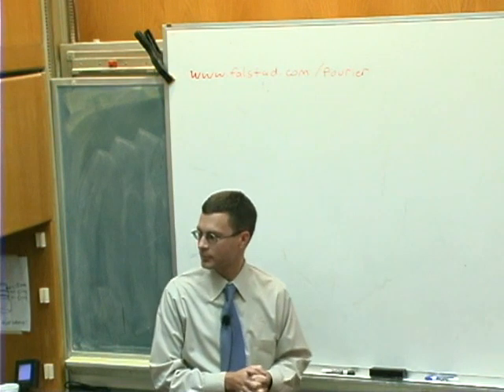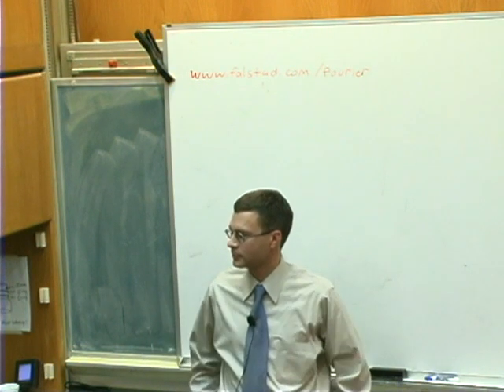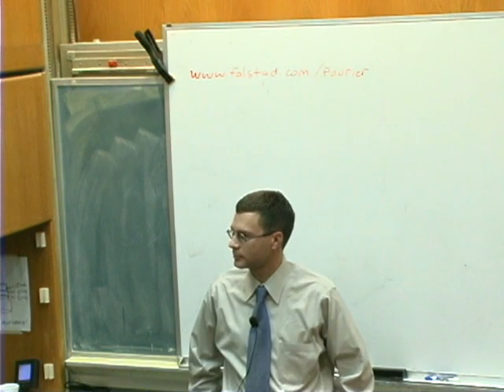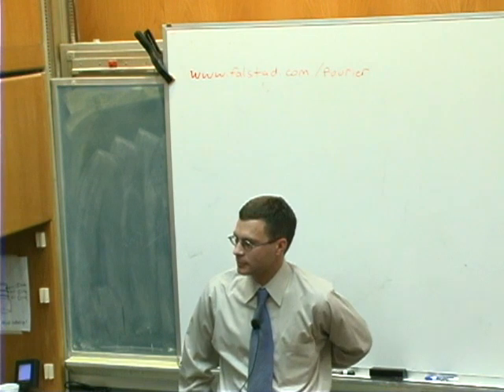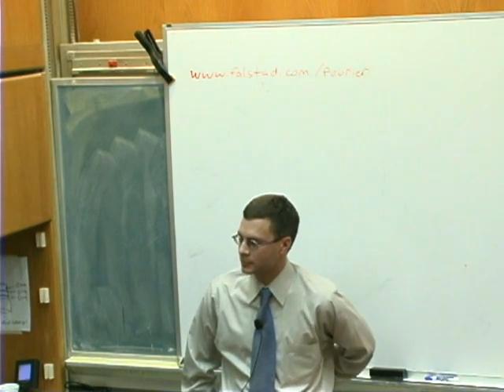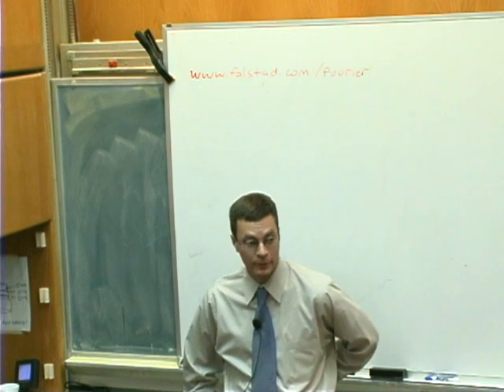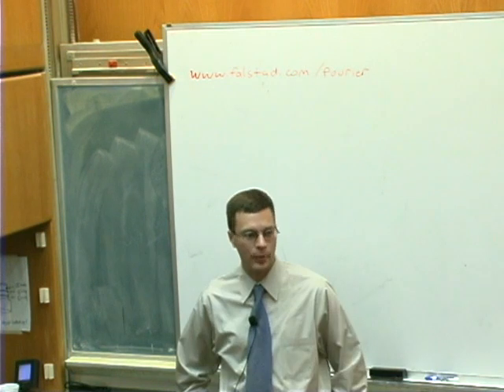The signal to noise is actually higher. Right. But I don't know. What do you think there? Yeah, signal to noise is higher, but the susceptibility effect is also higher. So in general, going to a higher field strength is better, but there are some greater technical challenges that accompany that. I don't think it's directly related to 1 over f.